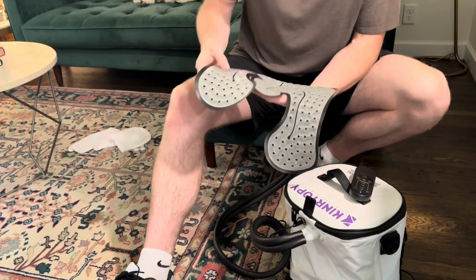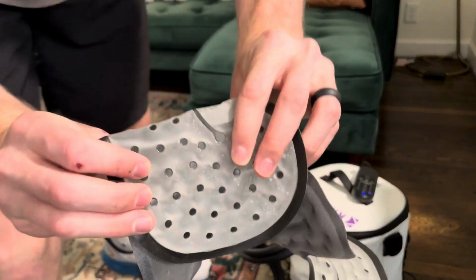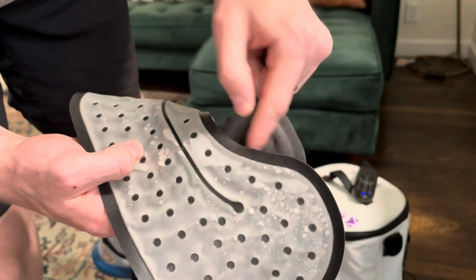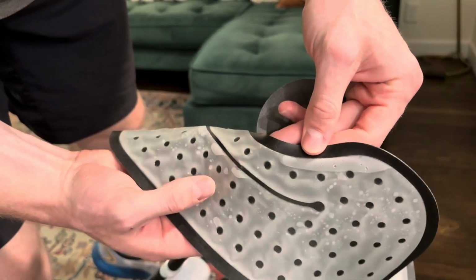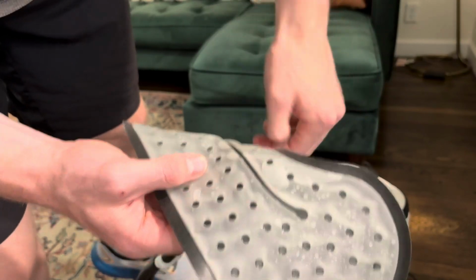Oh, that's cool. So yeah, let me fold this so you guys can see how the water kind of shoots through. So when I undo it, you can see it, like right here, the water is flowing. So I'll do it again. And then that water's getting pushed through there because it's being pumped right here. You can see that really easily.